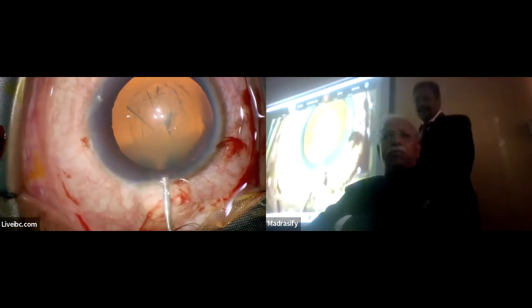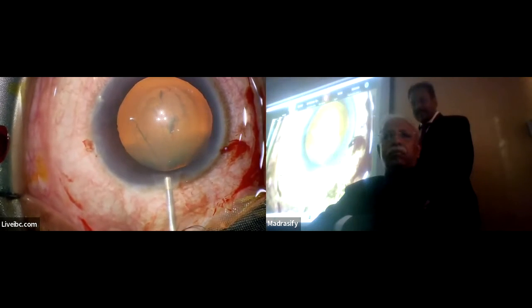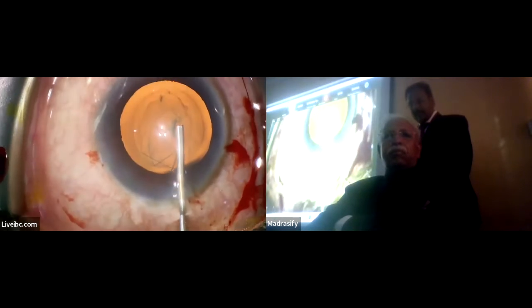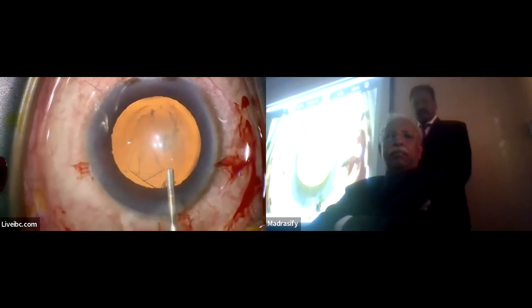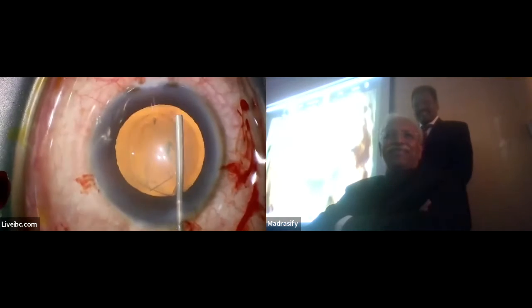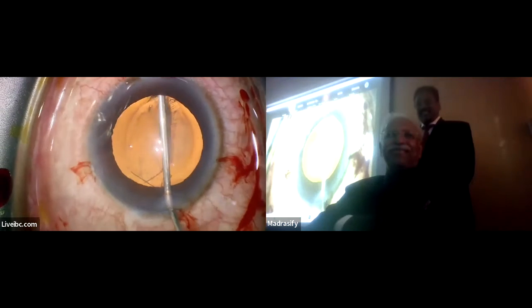We're performing the hydrodissection now. Let out some visco, shallow the chamber a little bit. Move forward. Under the flap, lift up, sweep.